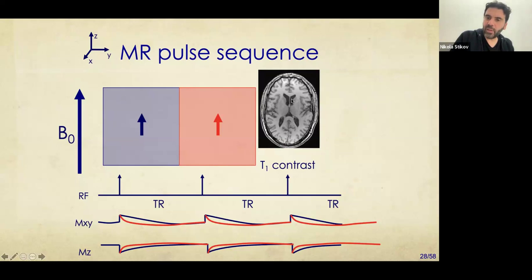And you see that in a T1 weighted image, the ventricles, which is the place where you have liquid with the cerebrospinal fluid, those appear dark. Whereas the white matter here appears bright. And then the gray matter is somewhere in between. You see the gray matter here in the sulci that has T1 values that are kind of between the liquid and between the white matter.